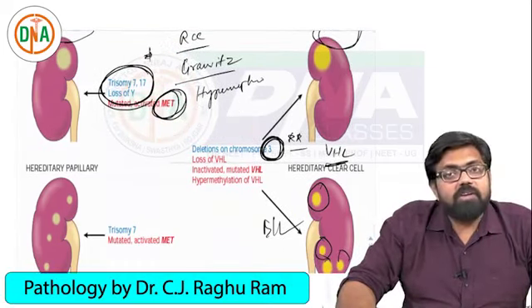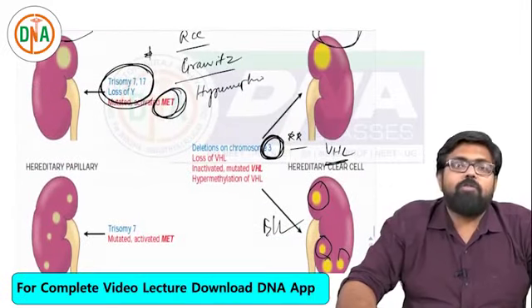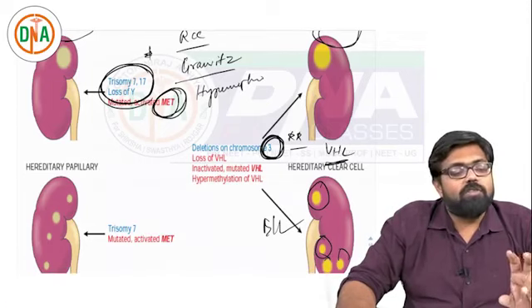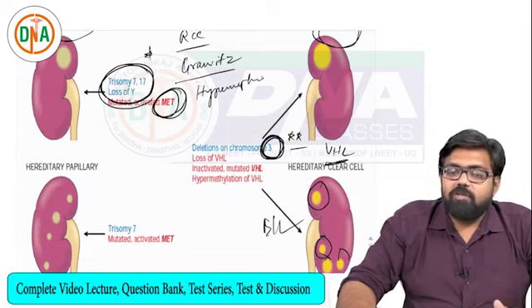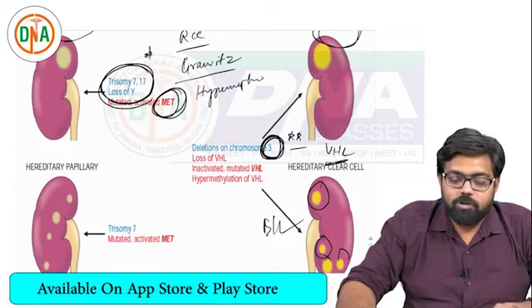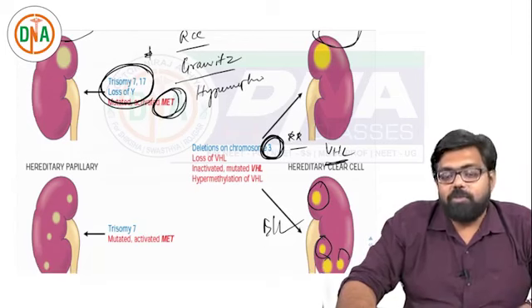The next one, very important, is chromophobe carcinoma, which is one of the malignancies that has a plant cell appearance, has a perinuclear halo, and has colloidal iron as a special stain which is helpful in the diagnosis. It arises from the collecting duct and has a very good prognosis. Of all variants of renal cell carcinoma, the chromophobe variant has the best prognosis.